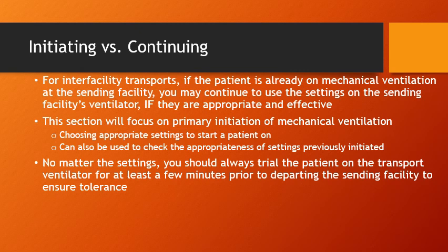No matter the settings you use, though, you should always trial the patient on your transport ventilator for at least a few minutes prior to departing the sending facility to ensure that the patient is tolerating those settings. Just because they're on a certain set of settings on the hospital's ventilator, even if you dial those exact settings into your transport ventilator, not all ventilators are the same.